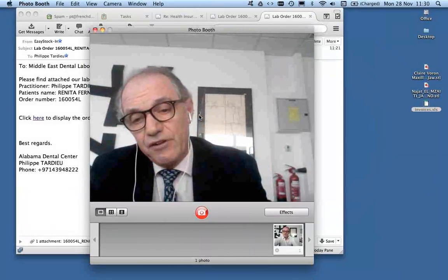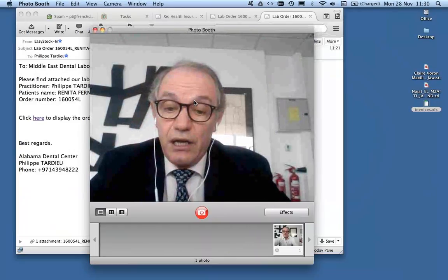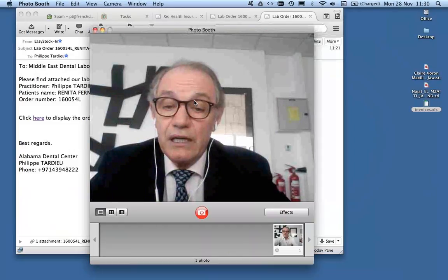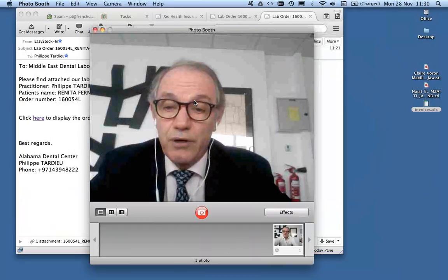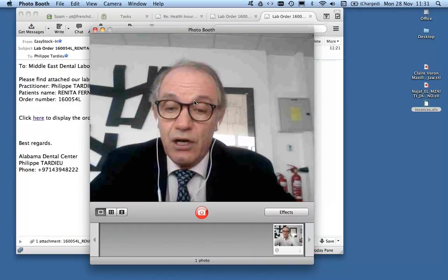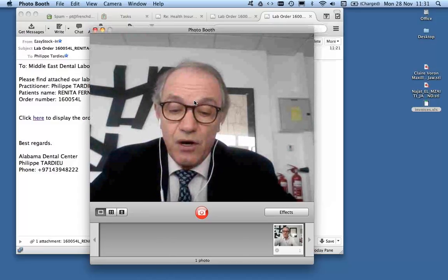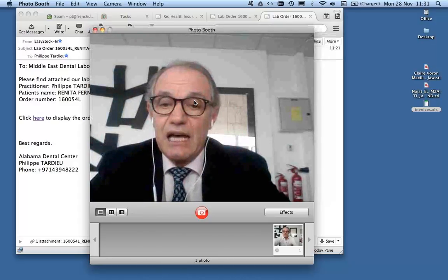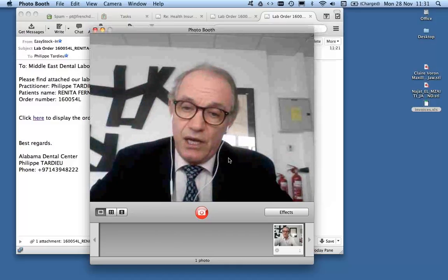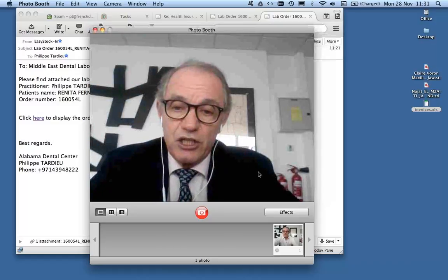We have an amazing new tool to work. You can start today. Everything is working. You can avoid keeping your old models full of dust. You have a full traceability. You can make a payment in an easy way with a group payment every month. And we've been able to solve all this nightmare that you have when you need to deal with the dental lab orders and the traceability of the product you're using and putting in the patient's mouth and all.